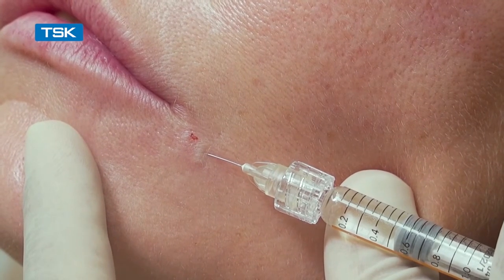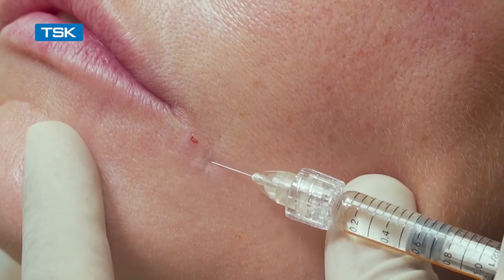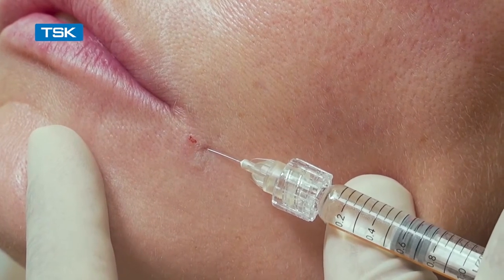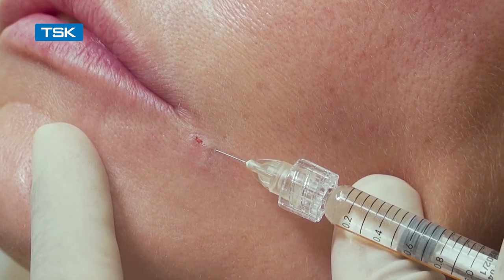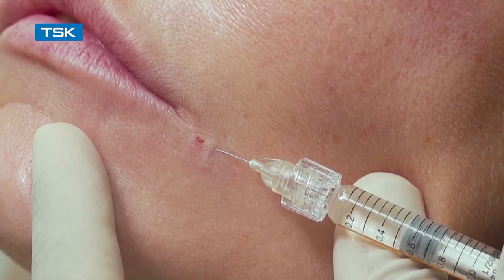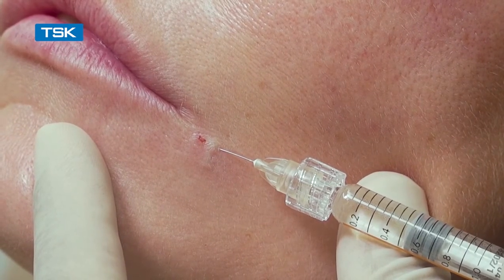This can proceed along a line to be superficially injected and make the line almost disappear. The needle stays quite superficial. The grey of the needle is visualised under the skin surface, so the injection is truly intradermal.